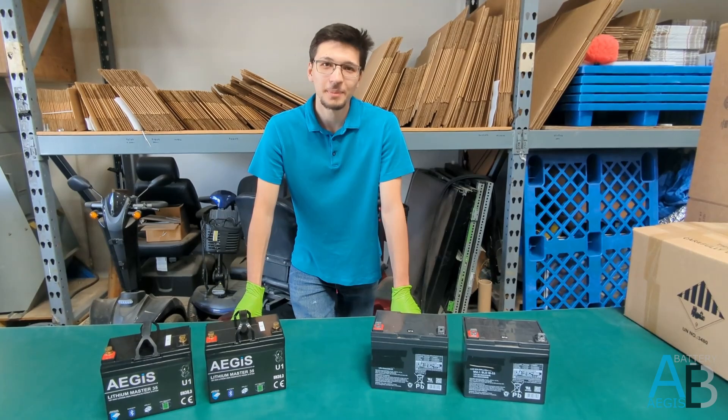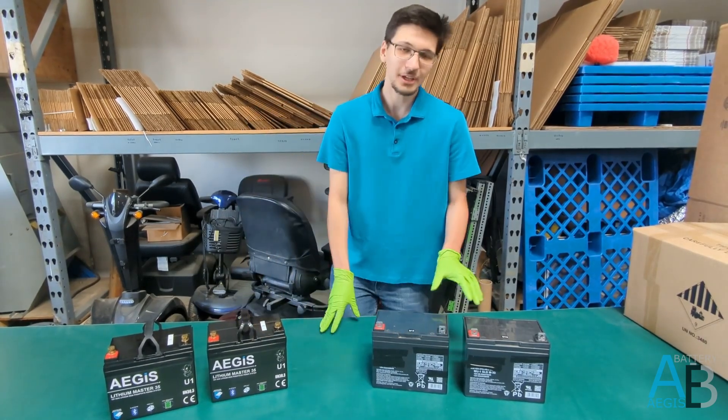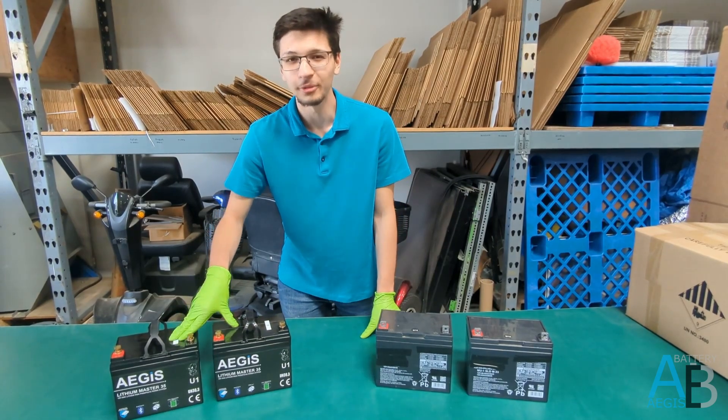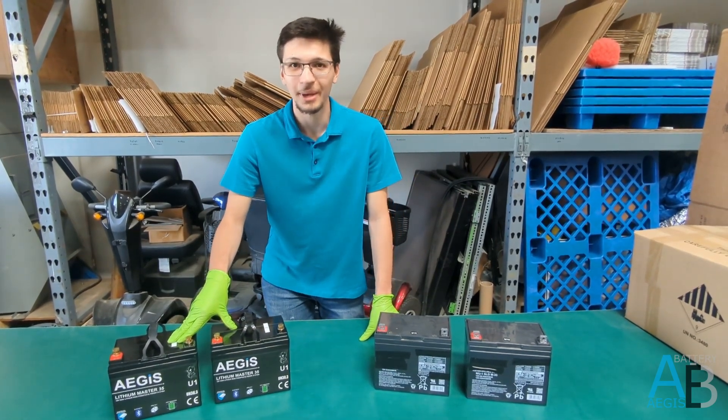Hi, I'm Jacob with Aegis Battery, and I'm here to show you a quick demo on how to replace mobility scooter batteries with significantly more powerful, faster charging, and longer lasting lithium batteries.